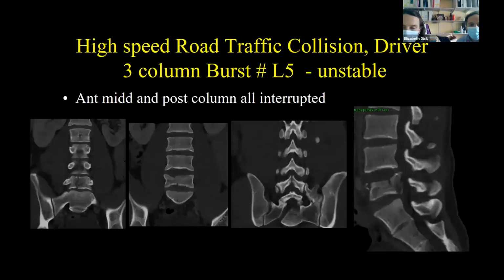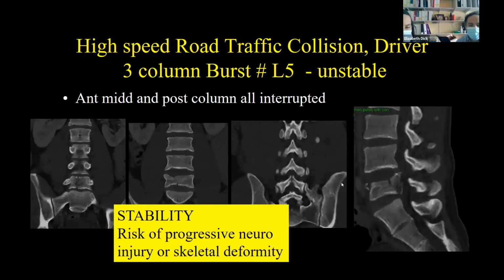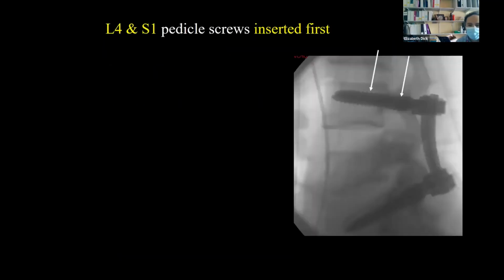So let's go through the first patient. There are 10 patients in total to go through. This is the first patient, who was in a high-speed road traffic accident. They've got a 3-column injury of L5, and you can see on the sagittal image how there's loss of height there as well. So we're concerned here, aren't we, about the risk of progressive neurological injury. So this patient had pedicle screws inserted. And Reza, I'm actually going to ask you if you could walk us all through how you do this, please.